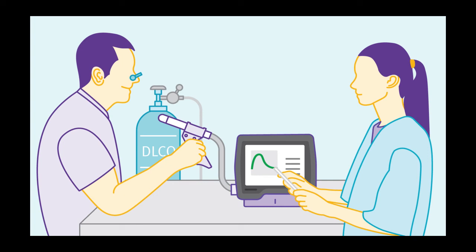FEV-1/FVC ratio is the ratio of the forced expiratory volume in the first 1 second to the forced vital capacity of the lungs. This means that the ratio is assessing the amount of air let go within the first second of a quick and sudden exhalation, after the lungs had reached their TLC. So, going back to the participant, his ratio is actually healthy and significant because the data implies that he is releasing the proper amount of air within the first second of exhalation.